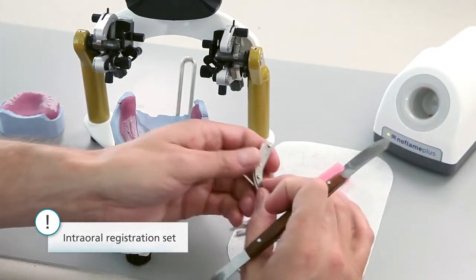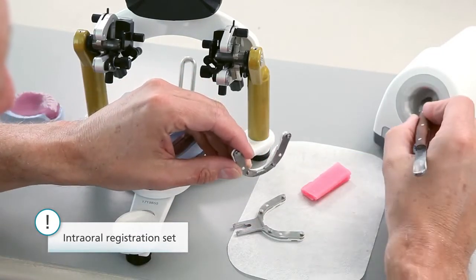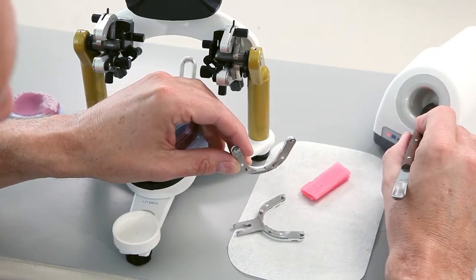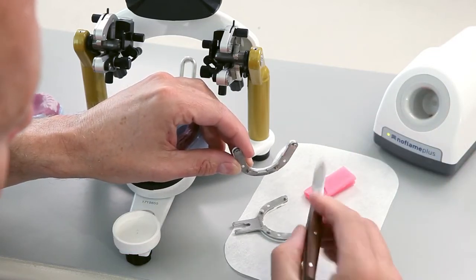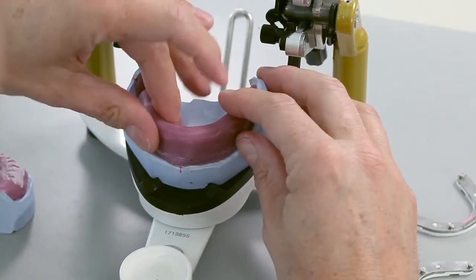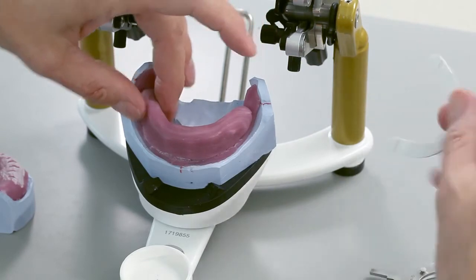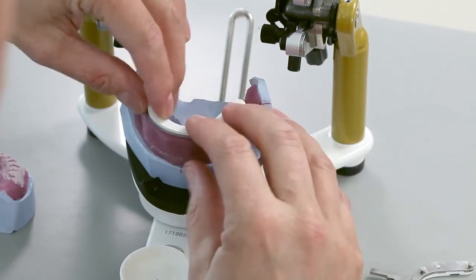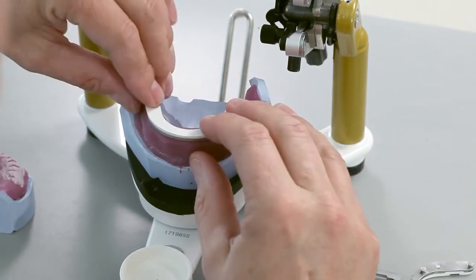Intraoral registration is particularly suitable for determining the maxillomandibular relationship in an edentulous patient. Protect the retention elements of gnathometer M with wax. Use tray material to build up the lower rim. Attach the gnathometer M bite support to the lower rim.